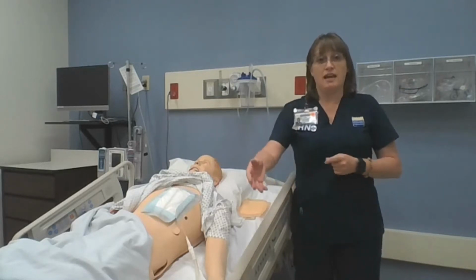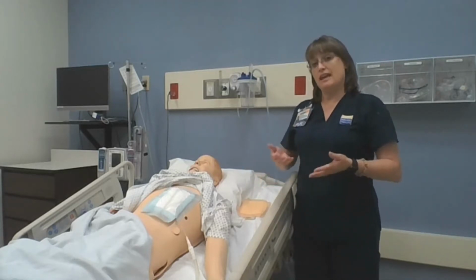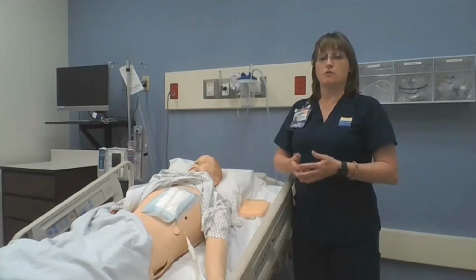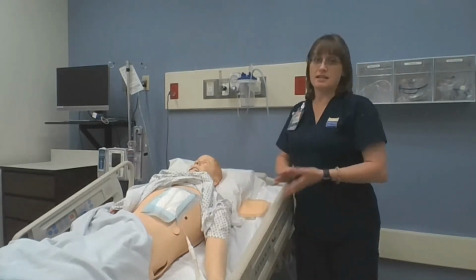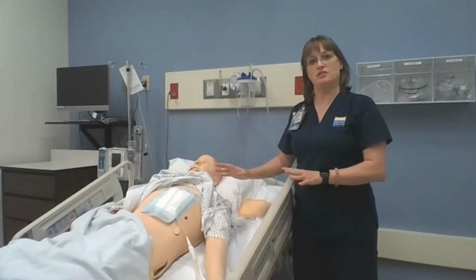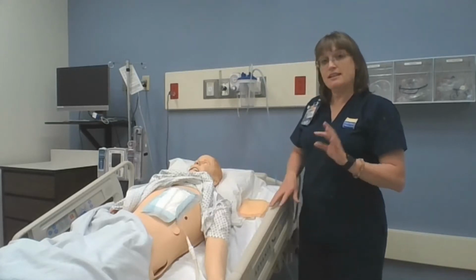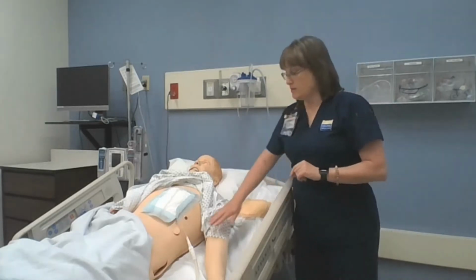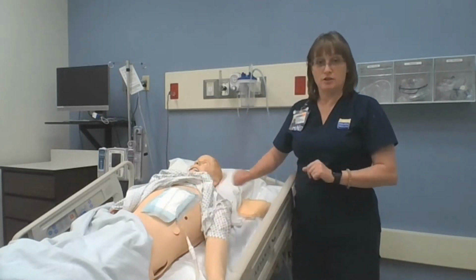When I go and extend my hand to say, hi, how are you? Can they carry on a conversation with me? If they can't, all of those things are signs of respiratory distress and could indicate that there's an issue with the drain that's in the pleural cavity. So I've come in and I've assessed my patient to make sure that they aren't in any kind of respiratory distress. The next thing that I quickly glance at is I always want to make sure that my connection is taped and secure before I start messing with the tube.